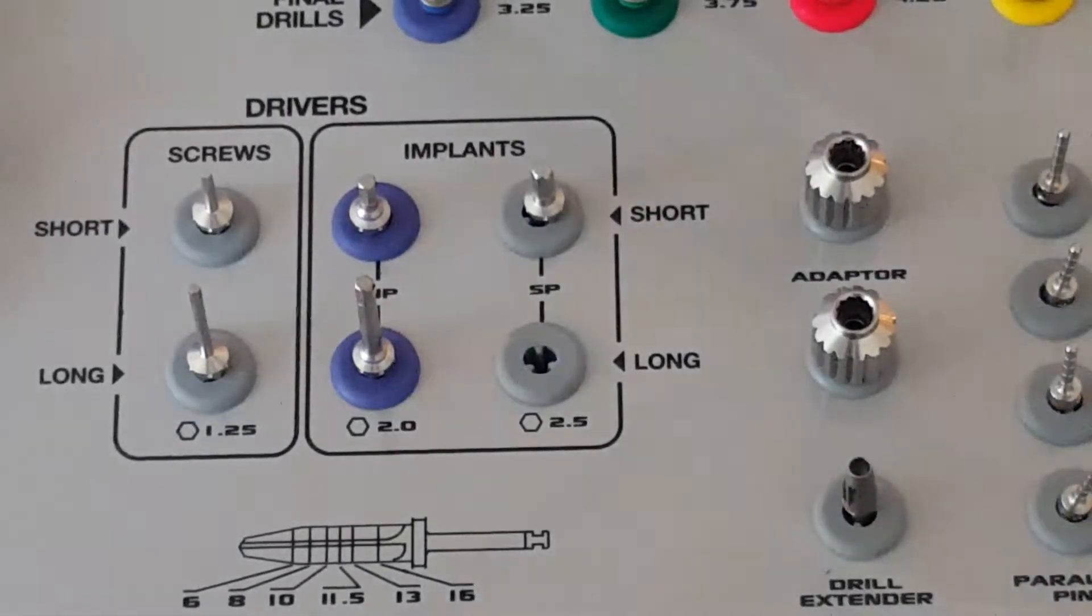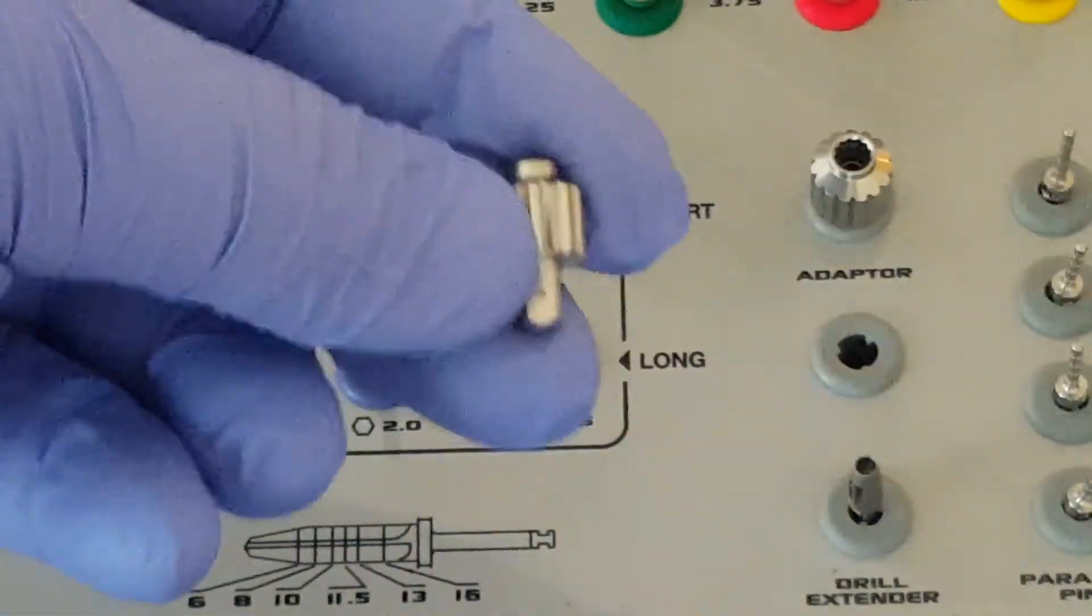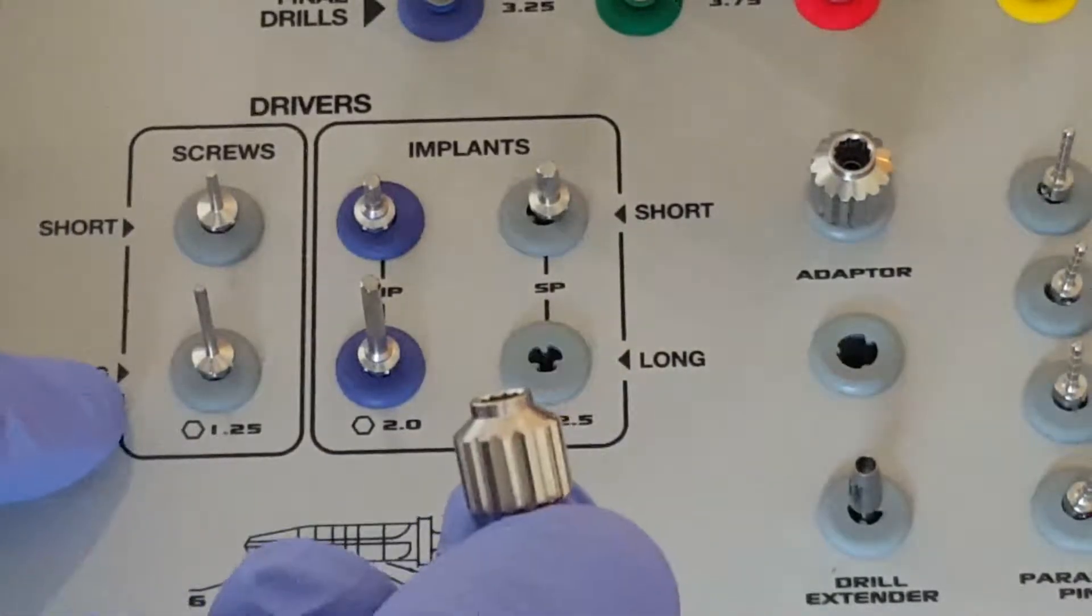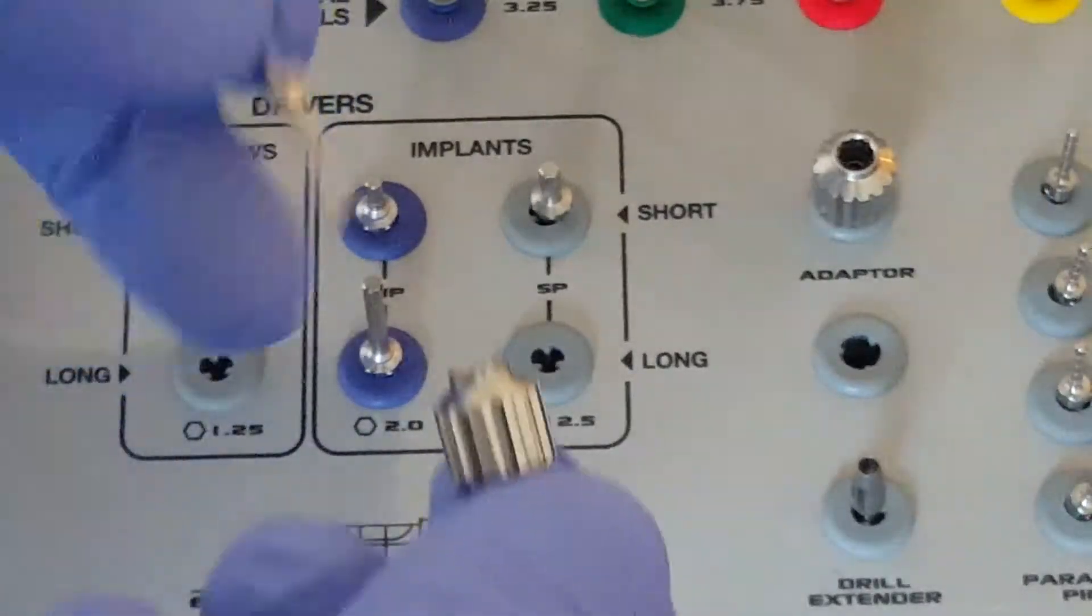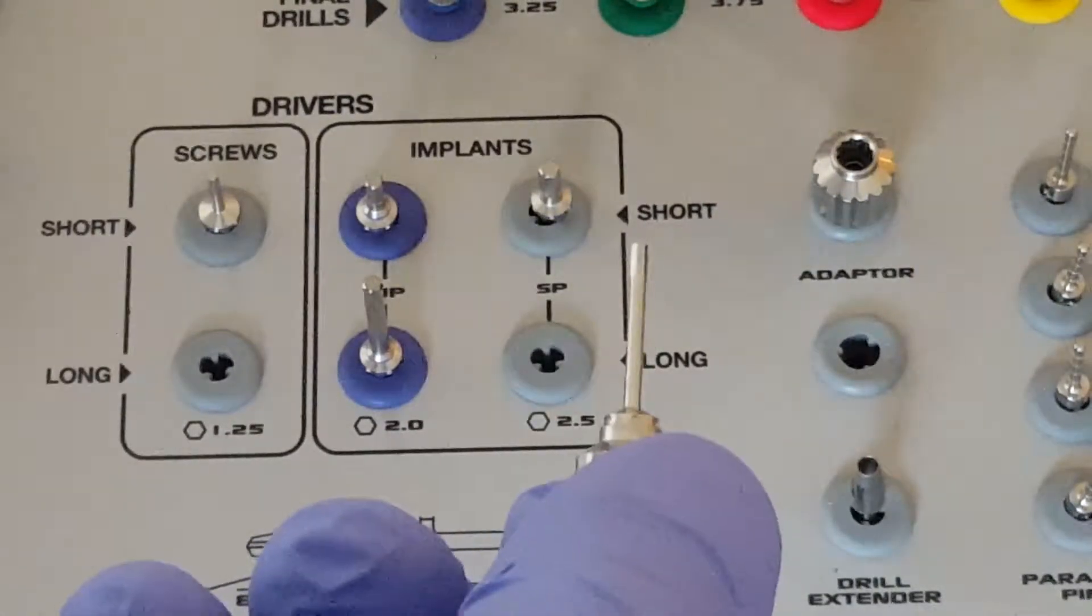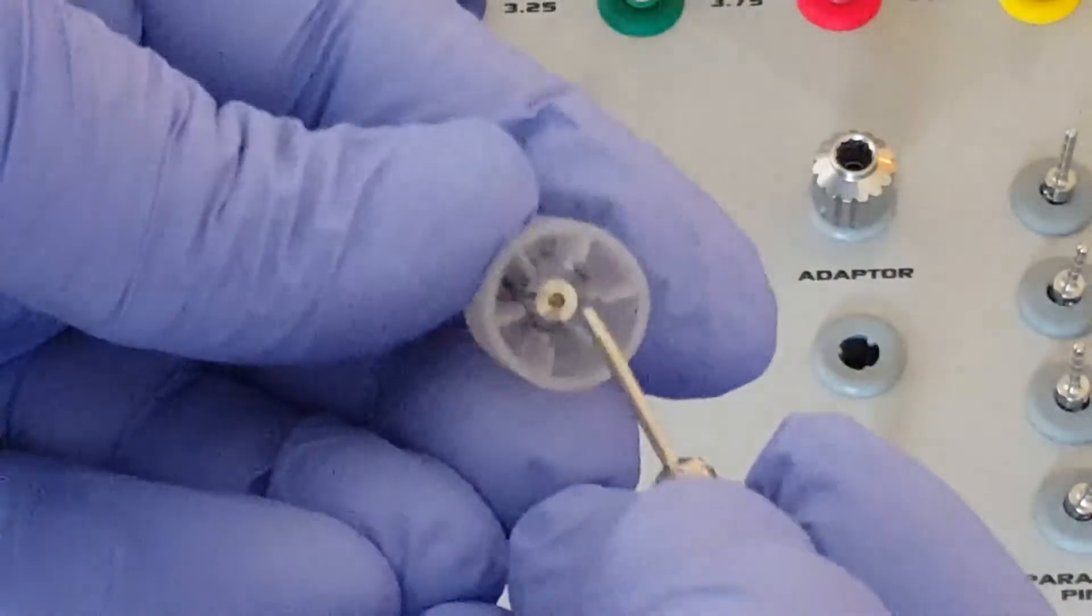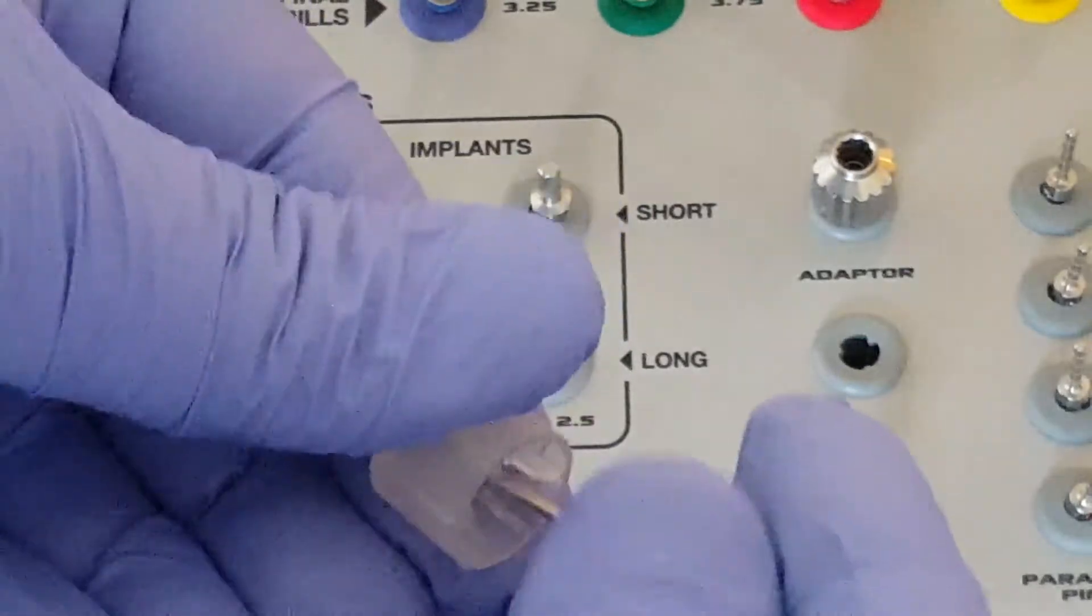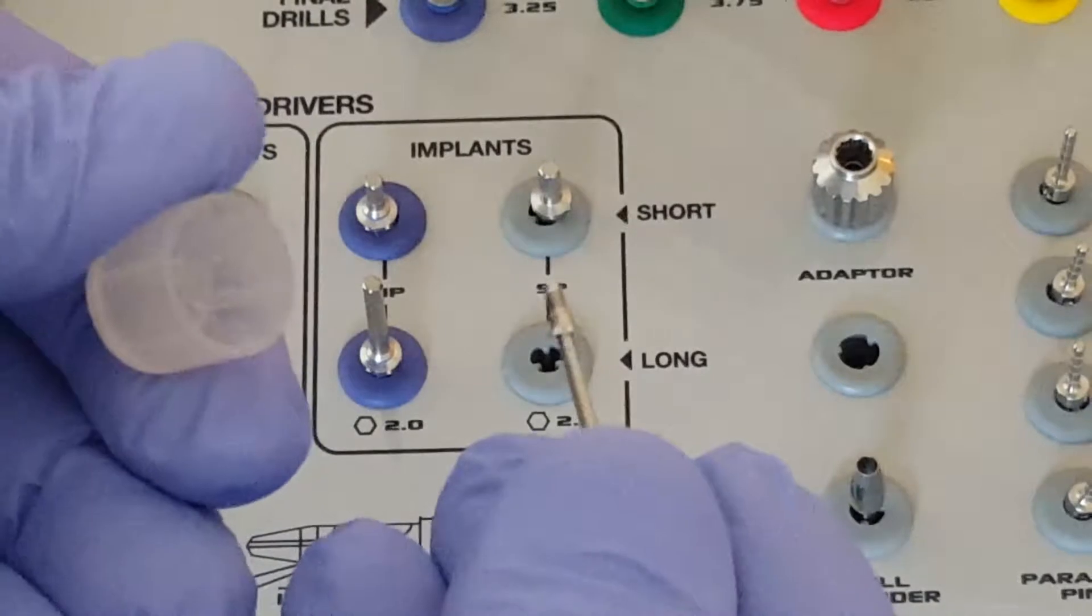When we need a screwdriver, we can take the adapter. If it's going to be a long screwdriver, we select the long hex key, or short screwdriver, the short hex key. We remove it and insert it into the adapter, and we've created a screwdriver. That screwdriver can then be utilized to remove the cover screw from inside the cap, and that cover screw can now be inserted into the implant.